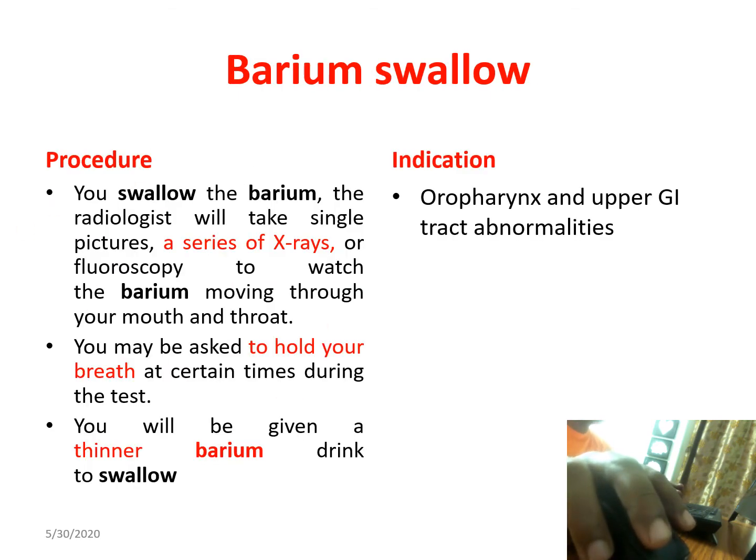So what is a barium swallow? Here you have to swallow the barium, and the radiologist takes a series of X-rays as it moves through the mouth and throat to the esophagus. Sometimes we show the swallowing properties, so we ask you to hold the breath or swallow during the examination and fluoroscopic examination. You will be given thinner barium to drink and swallow.